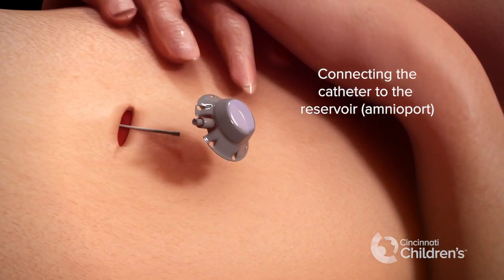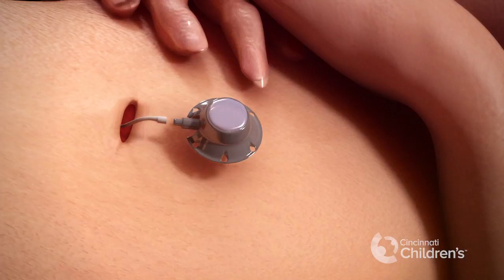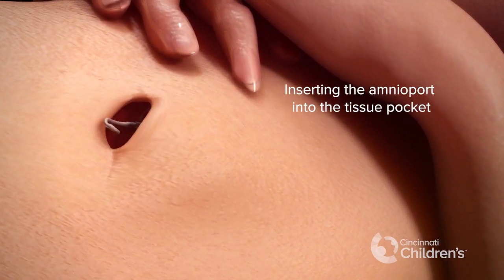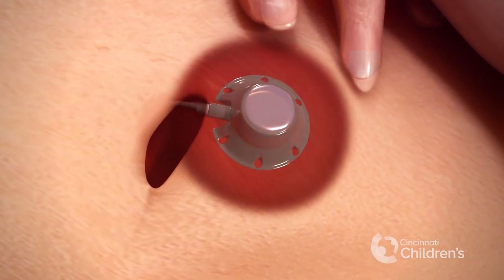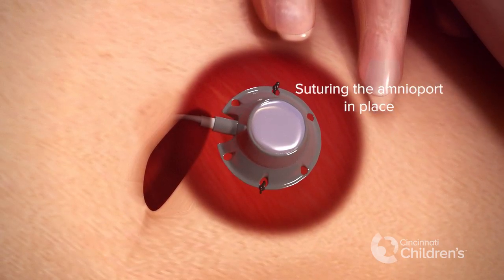The catheter is connected to the reservoir. We insert the amnioport reservoir into the tissue pocket, and the amnioport reservoir is sutured in place on the maternal chest wall.